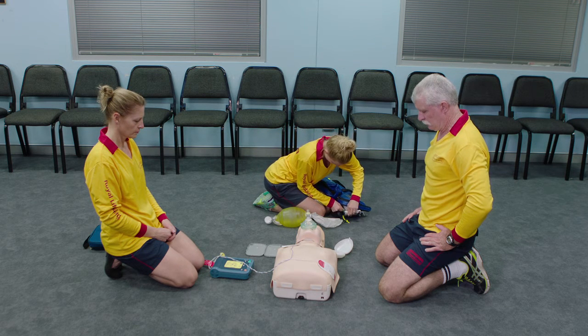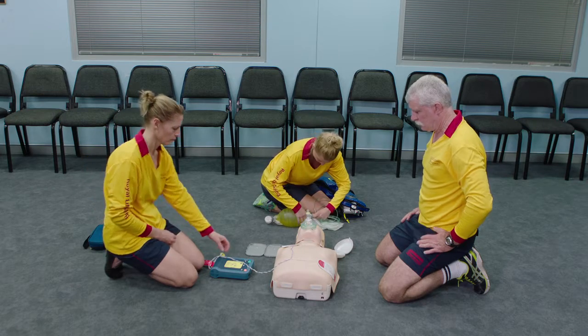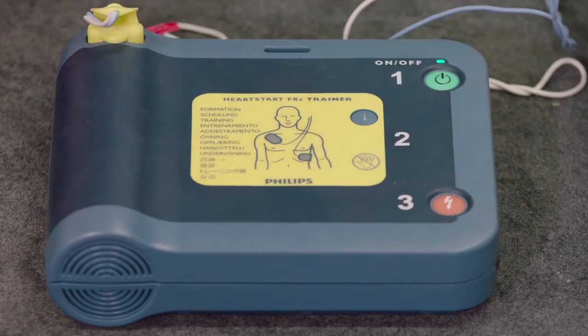Shock advised. Stay clear of patient. Press the flashing orange button now. Shock delivered.